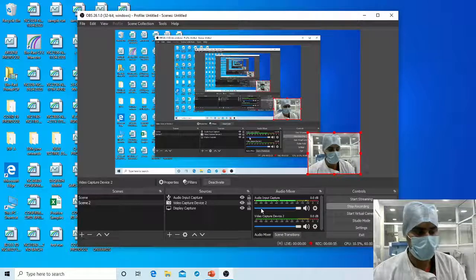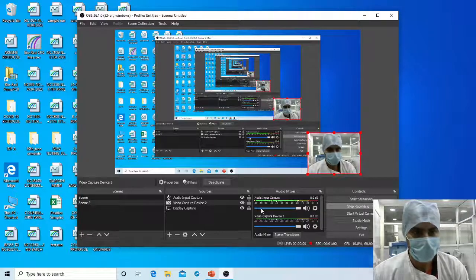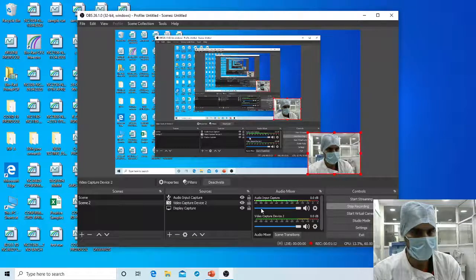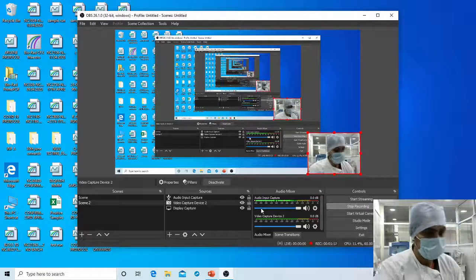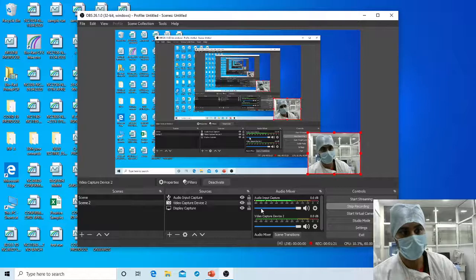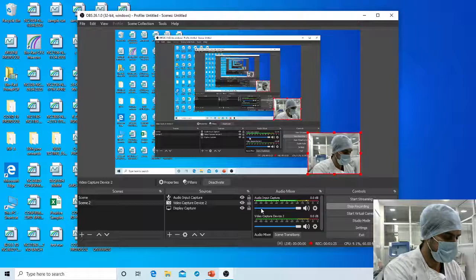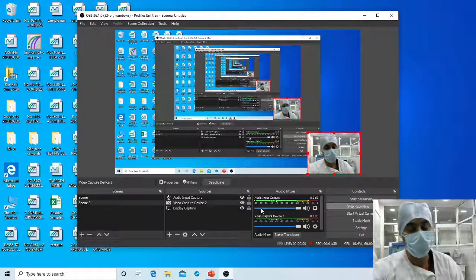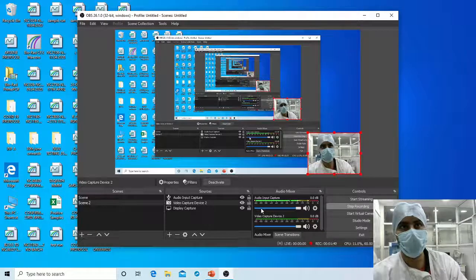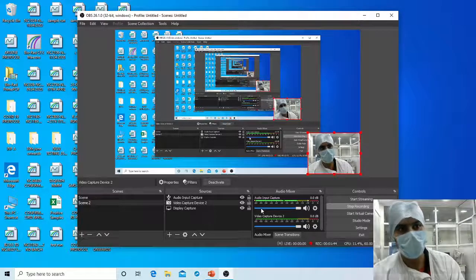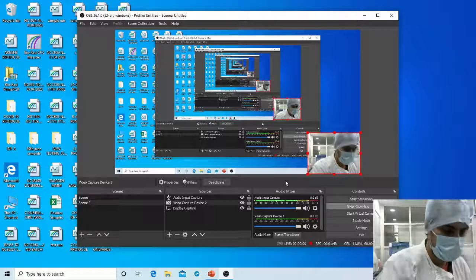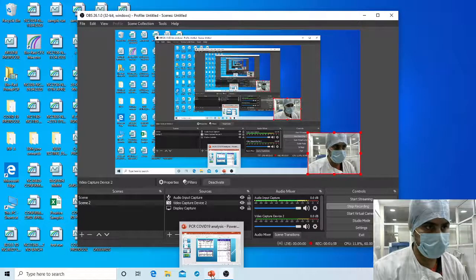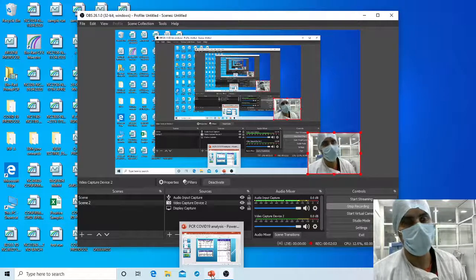Today we are going to discuss how we analyze real-time PCR results, especially for COVID analysis. Before analyzing the results, the very first thing you must know is which RT-PCR kit you have used to run the PCR for COVID detection. You must know the standards — what type of probe they used, what the cutoff CT value is, and what the threshold cycle is.